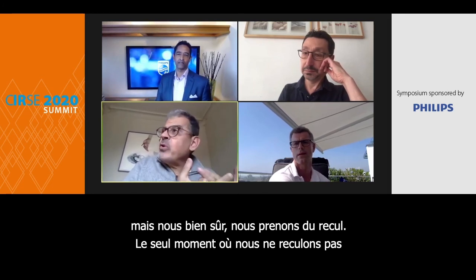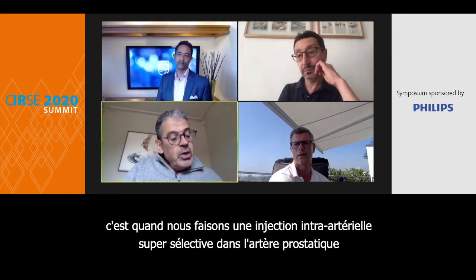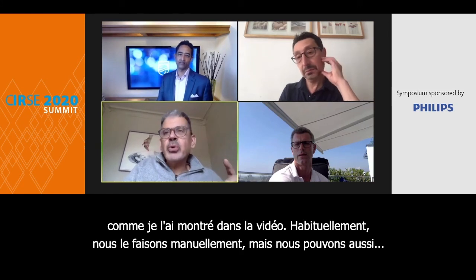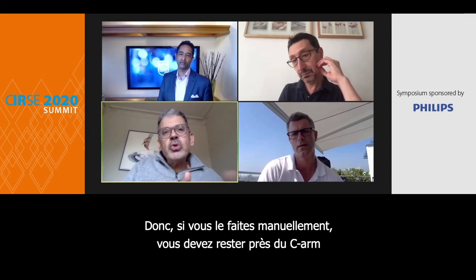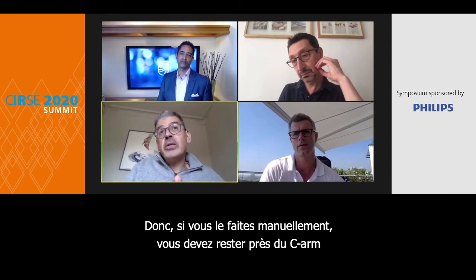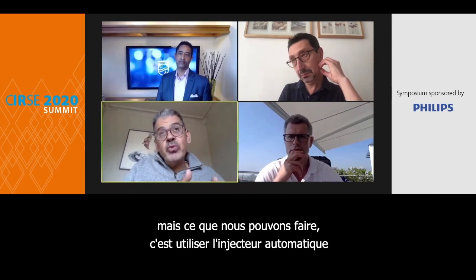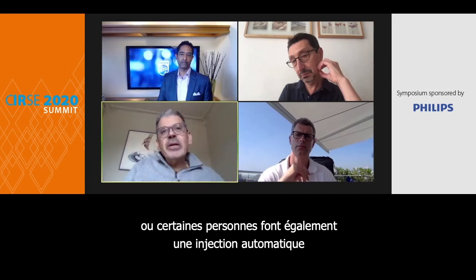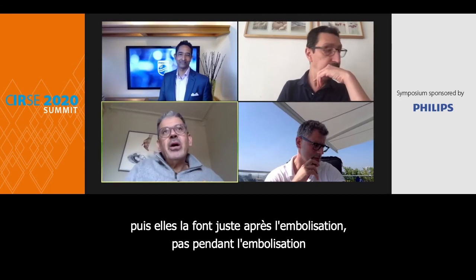The only time where we don't step back, and I know there is controversy on that, is when we do super selective intra-arterial injection in the prostatic artery, like I showed on the video. Usually we do it manually, so you have to stay close to the C-arm. But we can also use an automatic injector, or some people do the automatic injection after embolization, not during embolization. So this is another approach.